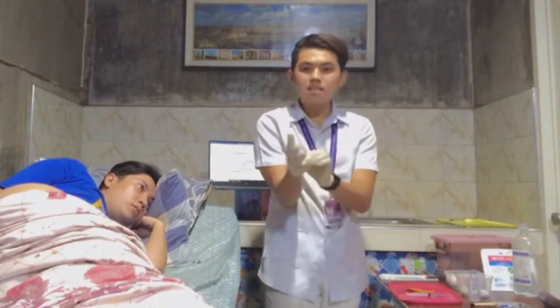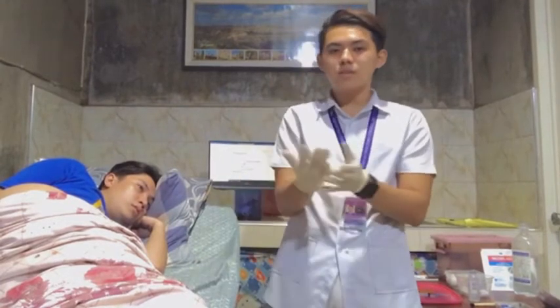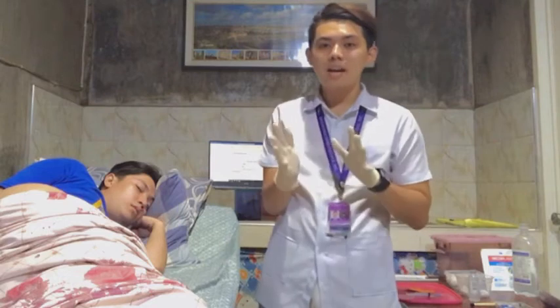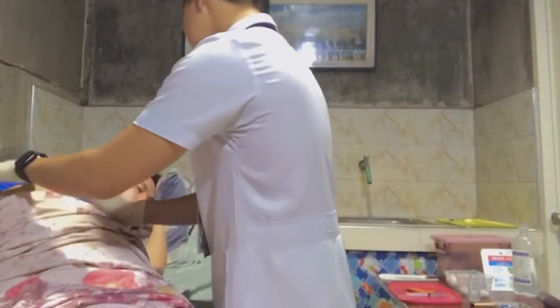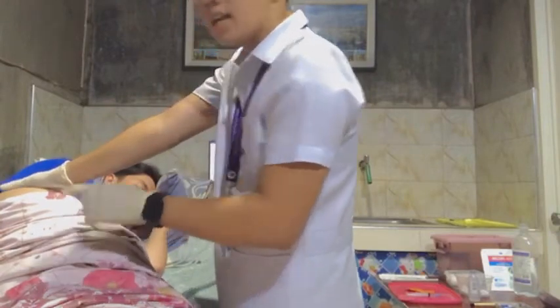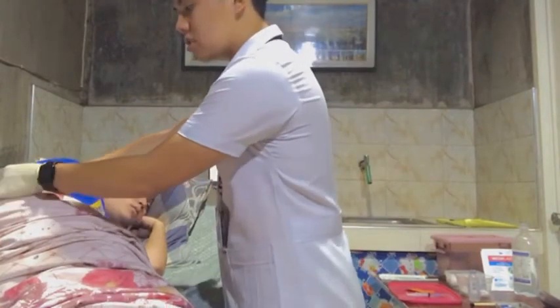Since this is for the ventrigluteal injection, which is preferred for adults and children more than 7 months old, we need to place the heel of your hand over the greater trochanter of the patient's hip with the wrist almost perpendicular to the femur. As you can see here, this is my thumb pointing here. We need to point the thumb towards the patient's groin.